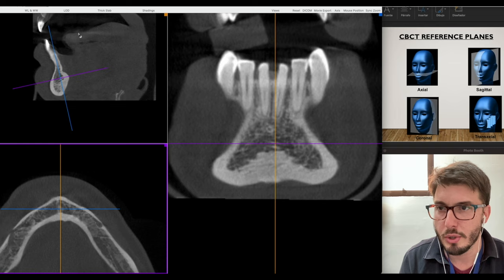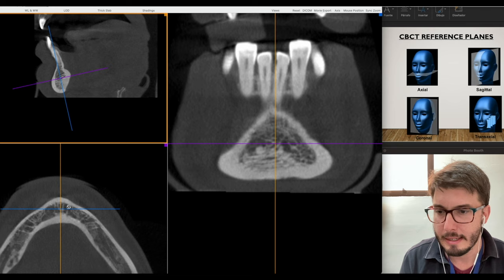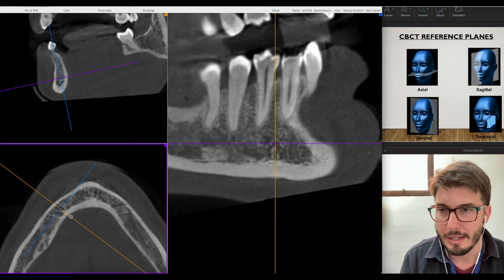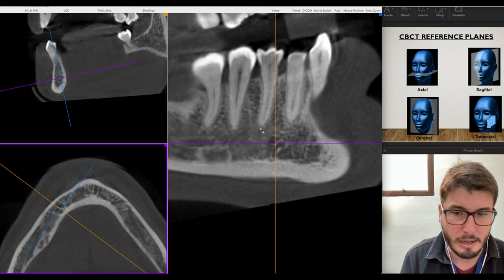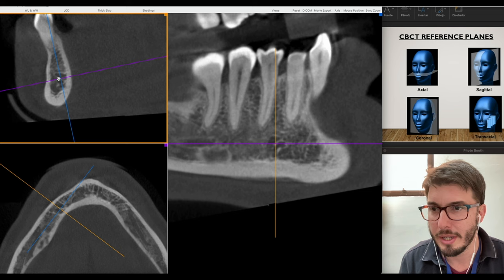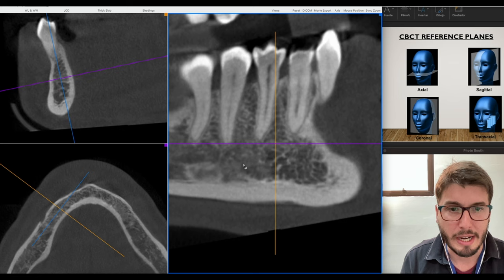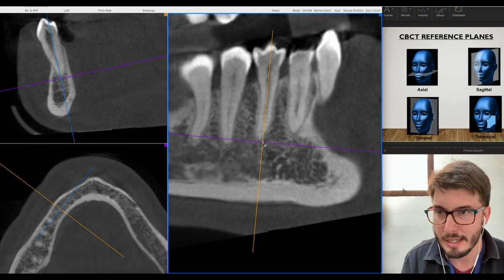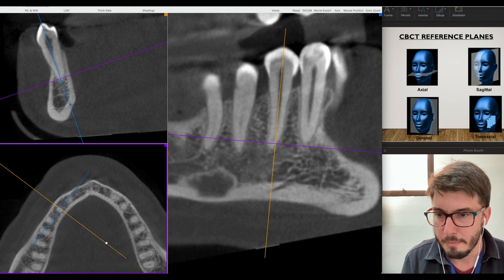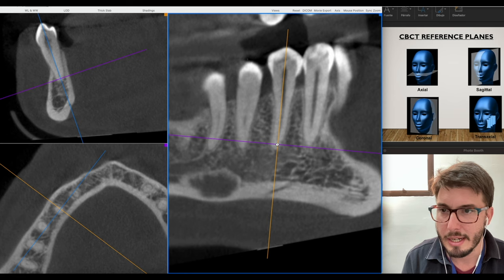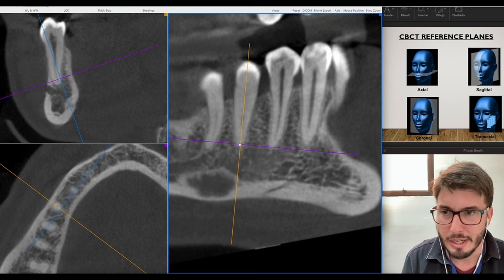Now moving to the posterior mandible — I'm tilting the planes to create what works as a coronal panoramic plane. This one is now a cross-sectional image of the alveolar ridge. Giving a zoom to assess each tooth — here I'm assessing the premolar. I put all the axes parallel to this premolar, perpendicular in the axial view, and now I can see the full relationship between the premolar and the bone.